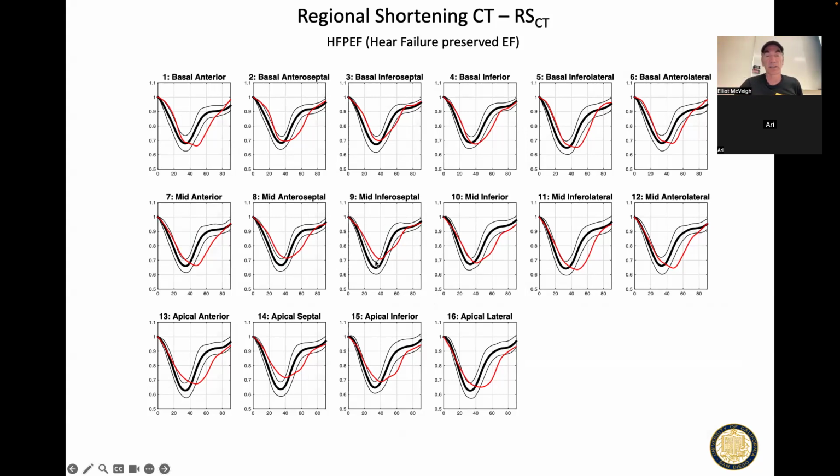So this person doesn't get as much squeeze done as a normal person. They're a little bit delayed, it seems, right? And see how in a normal person, it comes back up and then sits at a constant position. So it opens up and then sits there for a while in diastasis. This person really doesn't have diastasis. They're just up and down, up and down, up and down. So they're like a squeeze box just going like this. And that's classically heart failure.